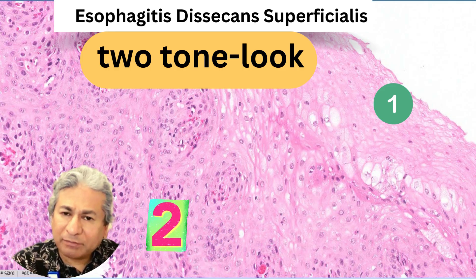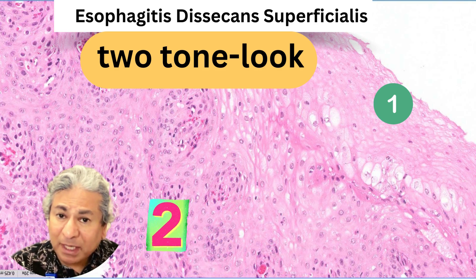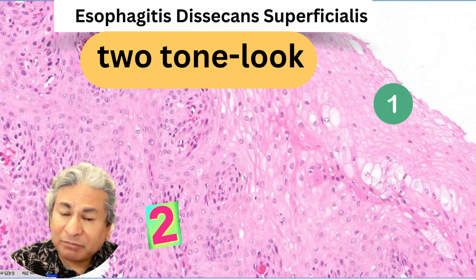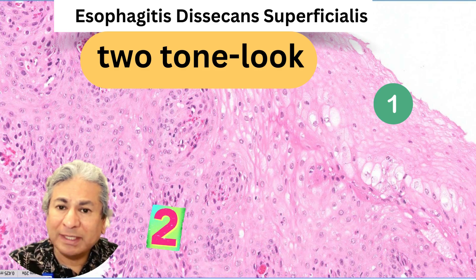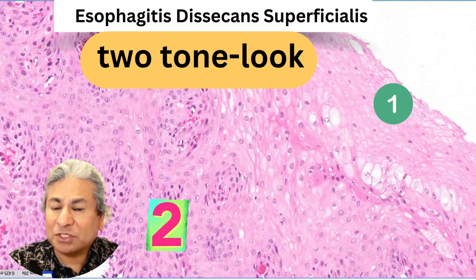It's important to note that not every case will show all of those classic features. In some cases you'll see prominent perikaratosis, but you may not see that mummified layer, or that mummified layer can be very subtle. You may not see that cleft as well. So watch for that two-toned look to the esophageal squamous mucosa — that is a very helpful sign in instances where the changes are subtle.